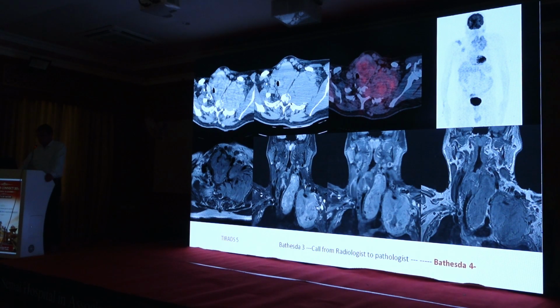And if we see the MR, we can see that there is no involvement of the trachea, neither the perichondrium is involved, neither the mucosa is involved. And this is the advantage of the MRI over the CT, where the soft tissue resolution is extremely high.